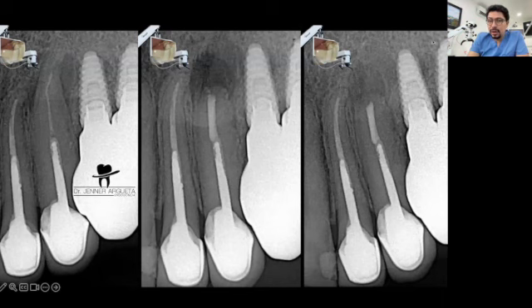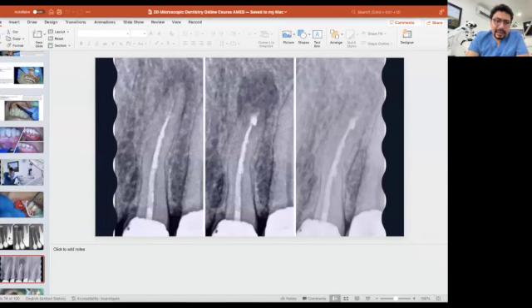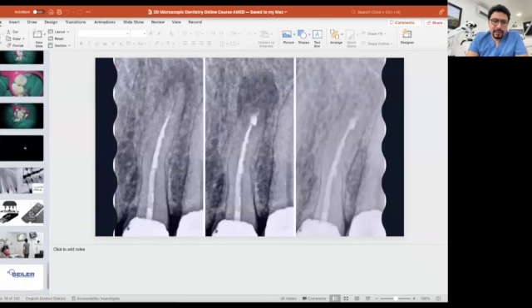We were very close to this implant in the area. So it was a challenging surgical procedure. We managed to do that surgical procedure, and after 3 months, you can see that the periapical area is healing, and it is possible because of the magnification that we have in the area. That is what we are looking for.